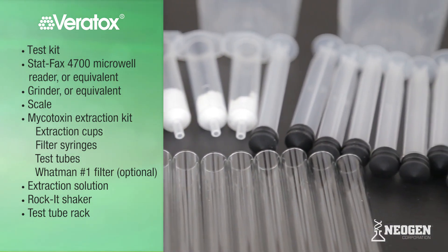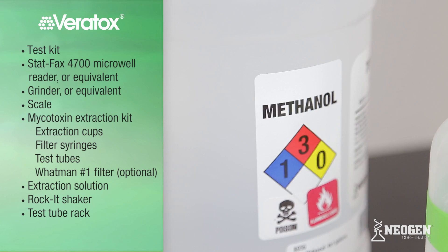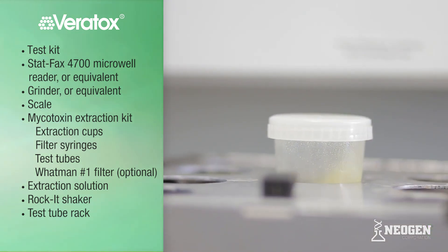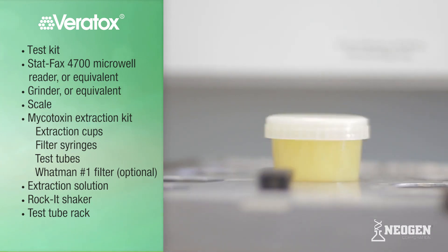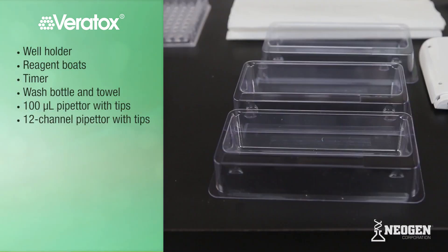A Whatman number one filter and funnel may also be used for sample filtration. Extraction solution specific for the test kit you are using — either 70% methanol, 50% methanol, or deionized or distilled water. A Rock-It shaker or equivalent, if you are extracting multiple samples at once or wish to use a mechanical shaker rather than shake by hand. Test tube rack, well holder, and reagent boats.